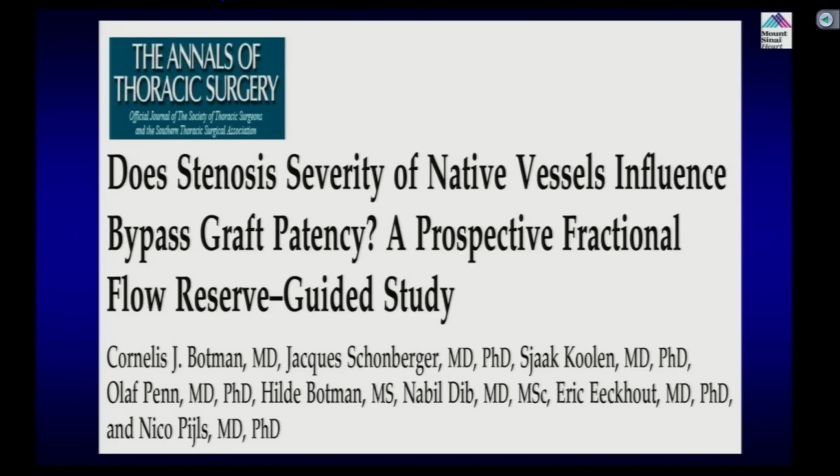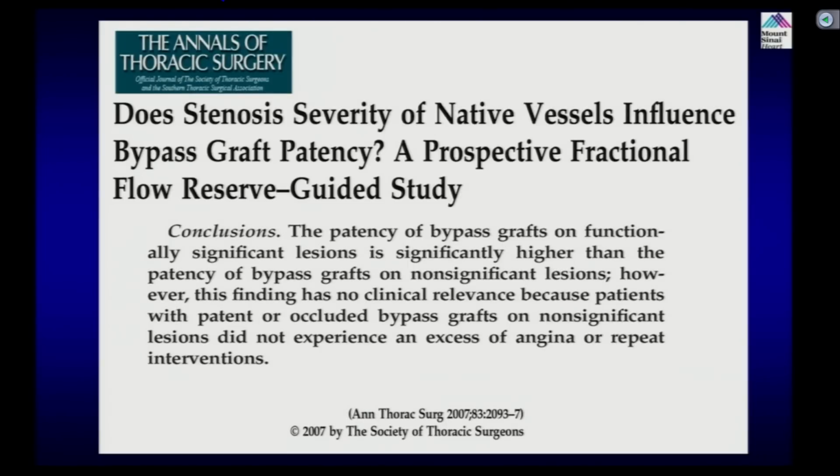And there are a lot of the questions that if you have a stenosis, whether less severe stenosis or more severe stenosis, angiographic, they have a higher graft occlusion. We know the competitive flow which we see so many times in patients. So once you have competitive flow, many times the graft occlusion occurs more because the proximal lesion where the graft is inserted is not significant, and the graft is kind of useless because you have more native flow.